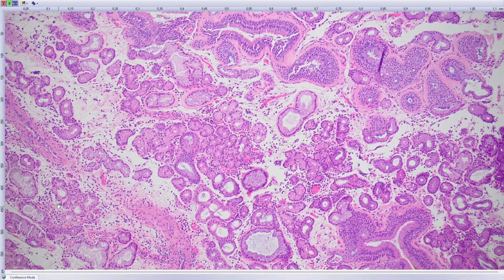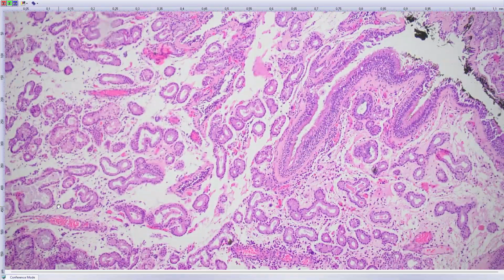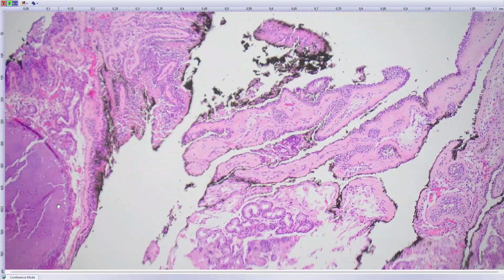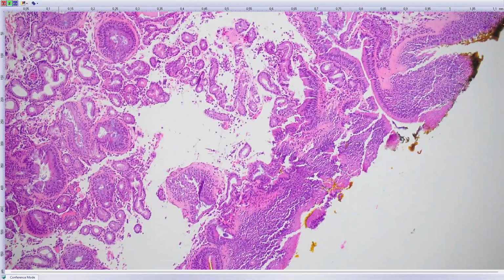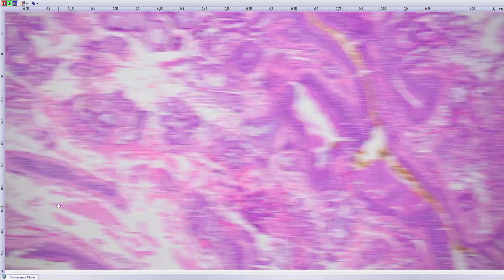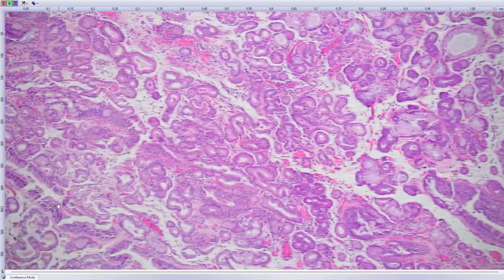I'm sure it's a tumor, and this tumor is not recognized in the WHO classification. We call it tumoriform seromucinous hamartoma, and hamartoma we put in apostrophes. So we don't think it's a hamartoma, it's a benign tumor. Look how big it is. And we have prepared a publication on these big lesions of the nose.